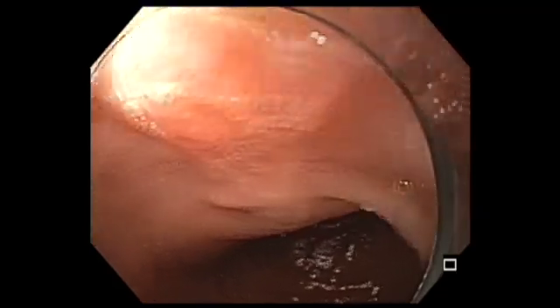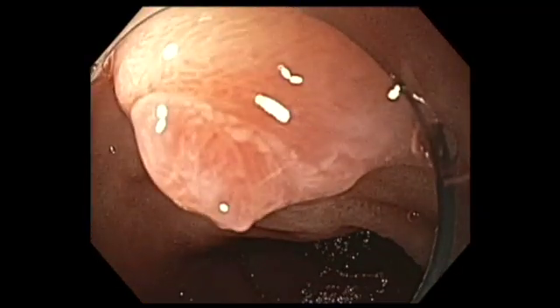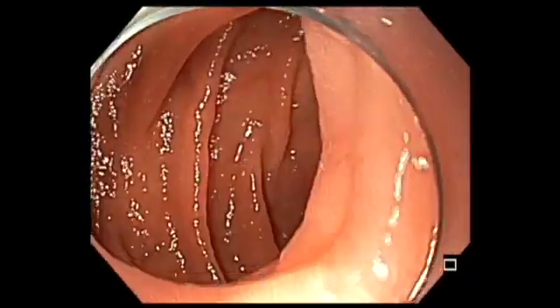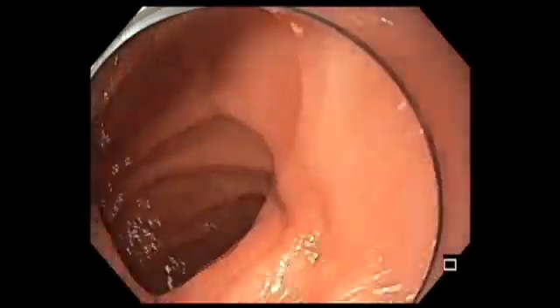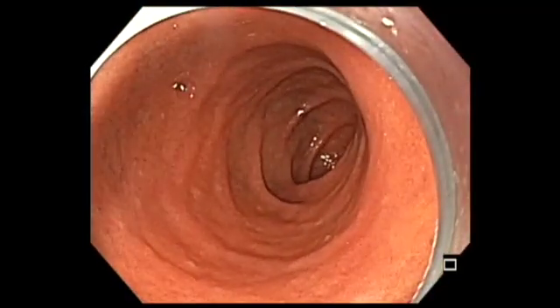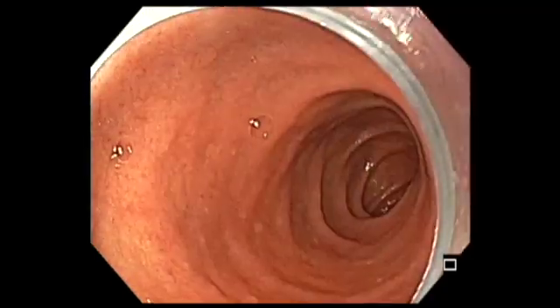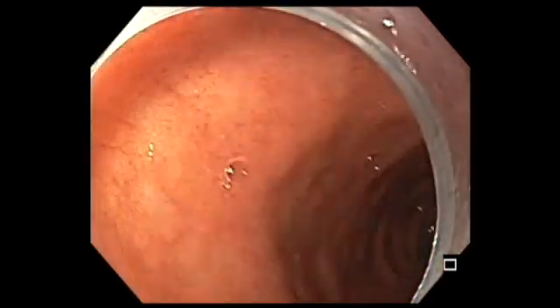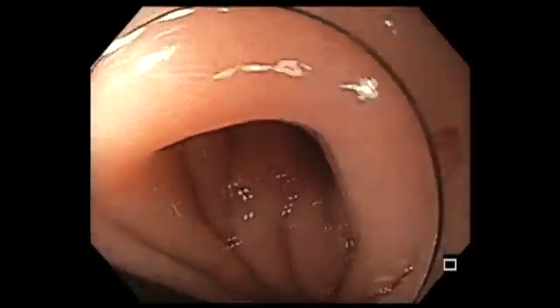The other advantage of the cap is that as the scope comes back into the first portion of the duodenum, it tries to elongate the bulb so that you could look at the duodenum better, and you are likely to find lesions that you would have otherwise missed without the help of a cap.